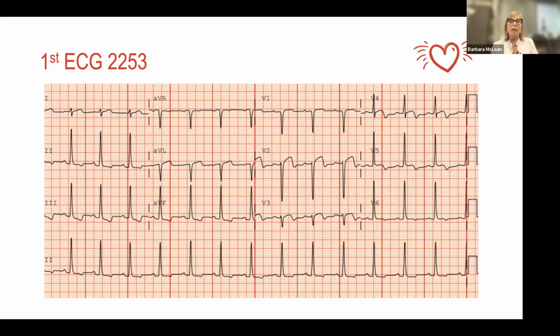He has some significant abnormalities. First and foremost, he does have ST segment elevation. That could be from LVH, but he has T-wave inversion. And you can see here in V2, V3, V4, and V5, he has T-wave inversion. Now, sometimes you're going to have T-wave inversion with ventricular hypertrophy, but typically the T-wave inversion will be in the leads where we've identified the most hypertrophy. So you would expect that possibility in V4, V5, and V6, but not necessarily in the right-sided leads.